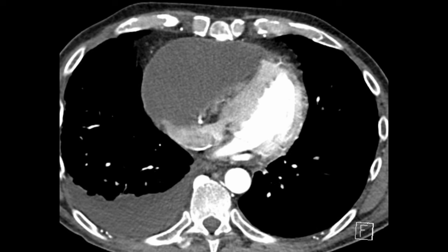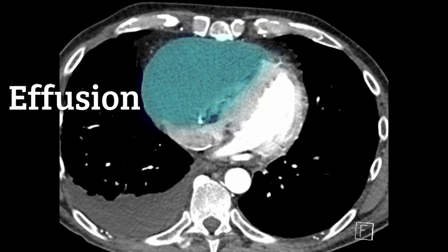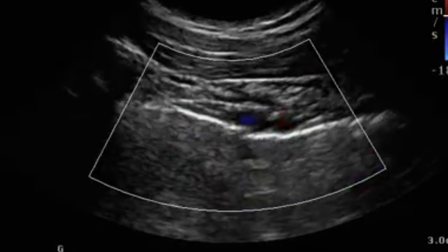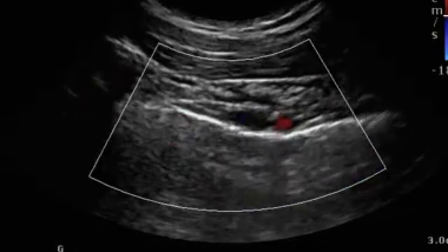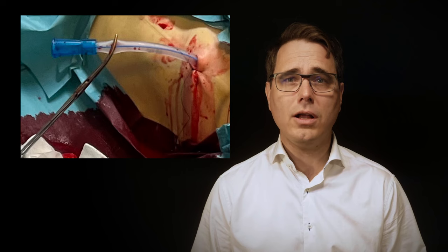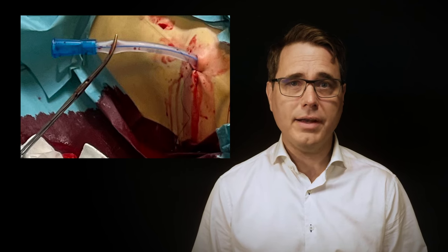This CT angio shows a patient with a very localized right-sided effusion. The right internal mammary artery lies between the skin and the effusion — it's the white dot of contrast marked with the red circle. The arteries are easily visualized with ultrasound and are easy to avoid. Look at the red flashing left internal mammary artery in this sequence. Coagulopathy is not a contraindication with our approach. As long as the needle is visualized at all times using in-plane ultrasound guidance and relevant arteries are identified, there will be no torrential bleeding. We've done pericardiocentesis in patients on ECMO who are fully anticoagulated, and it's been fine, but caution is warranted.